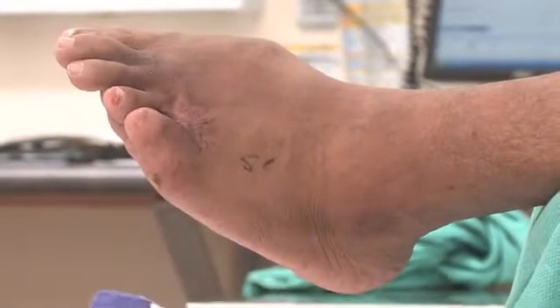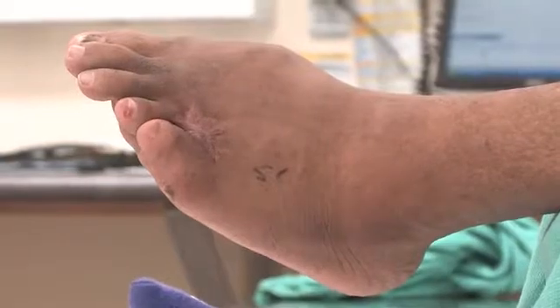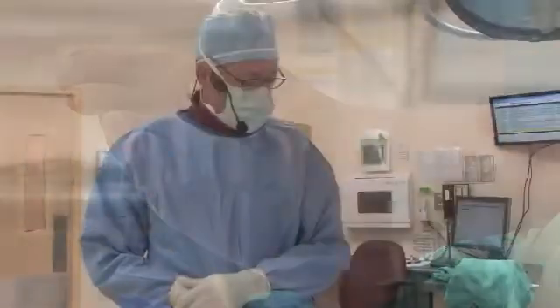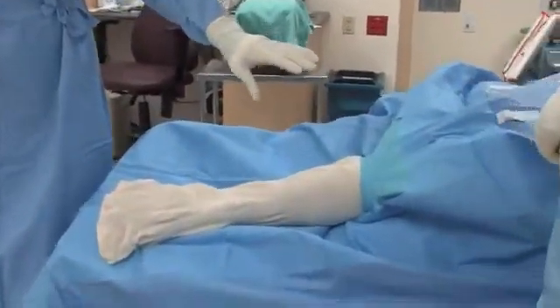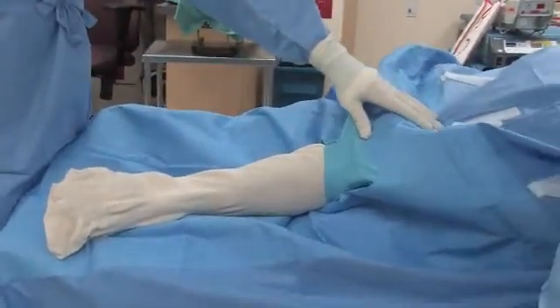Some of the thought process behind a soft or hot Charcot is to immobilize it, and I find that using a circular fixator can immobilize it pretty securely, and then if we have to, the patient can still bear weight with that external fixator on. Preparation for the case, we've put a popliteal block in the patient. He's under general anesthetic. We had the thigh tourniquet applied. It's not inflated at this point.